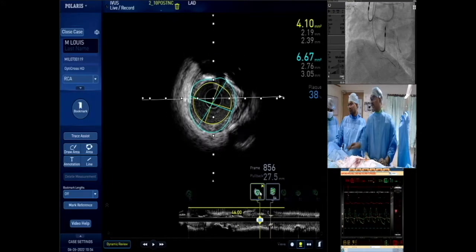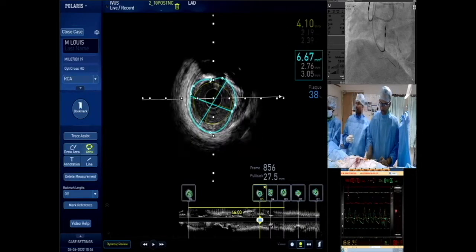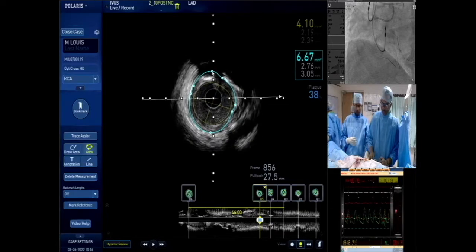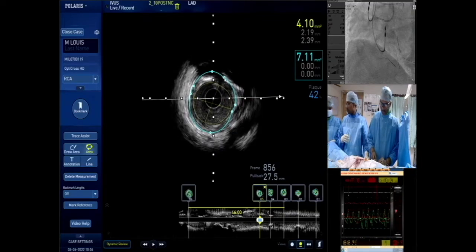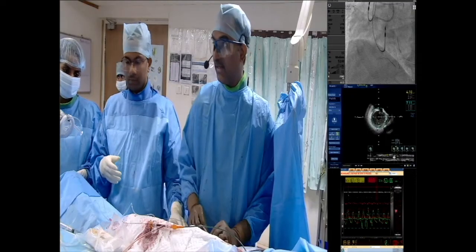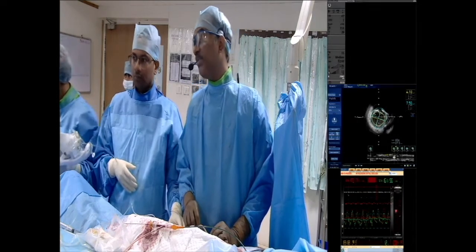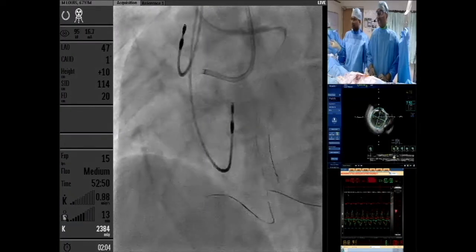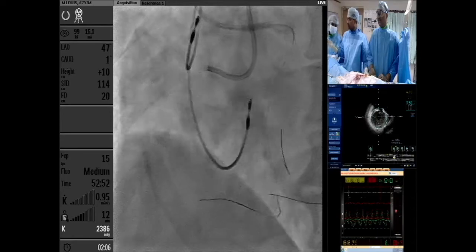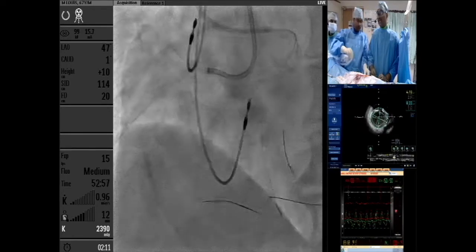But what normally happens is, now I dilated with a 2.5 balloon and we'll give a good NTG and we'll see how the distal vessel is and then we'll decide on where to do stenting. With this first IVUS, we thought we have to stent from B3 to B6. That is coming around 46 mm, which did not look like that, at least in angiographic assessment.